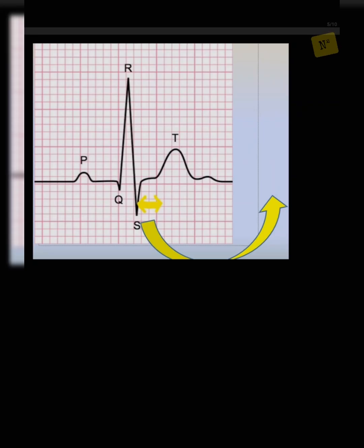The next very important segment is the ST segment. I told you, if we connect 2 points by a straight line, that is called a segment, whereas an interval is when 2 points are connected by a straight line and a curve.